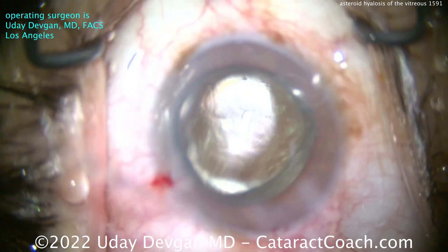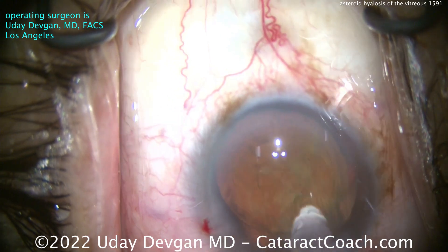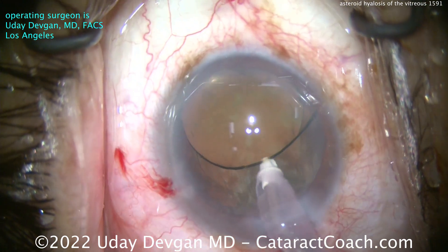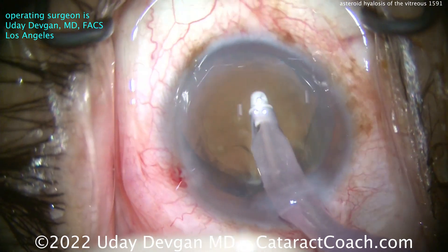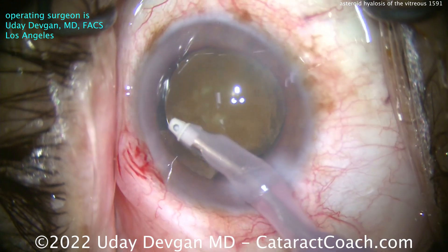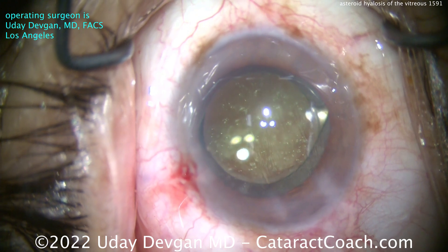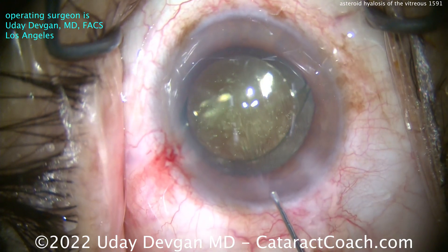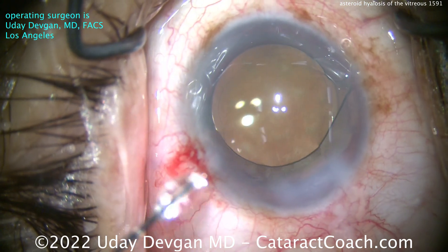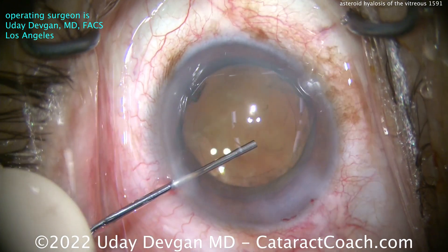Here we've cranked up the red reflex and you can look back in the vitreous cavity a little bit better. You can see the patient has a tremendous number of these bodies. In some cases, I have seen patients who need a vitrectomy in order to treat underlying retinal disease — patients who have macular degeneration or bad diabetic retinopathy. Sometimes if they have a very dense case of asteroid, they may end up getting a vitrectomy for diagnostic or therapeutic reasons: to improve the delivery of light to the retina, whether that's laser treatment, photodynamic therapy, or just for the retina specialist to be able to image the macula more clearly. Fortunately, our patient here has no other comorbidities and a normal-looking retina, so it's not likely to need a vitrectomy anytime soon.